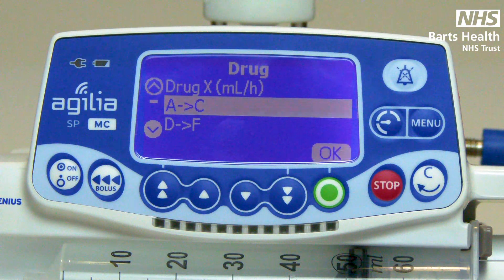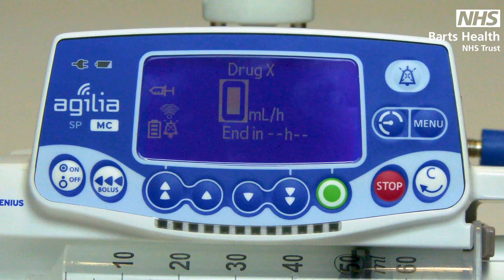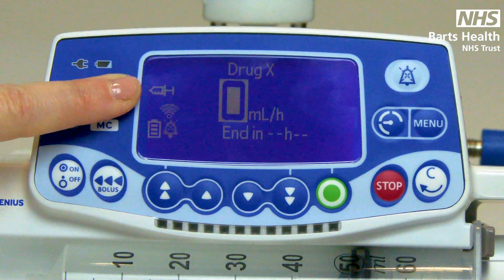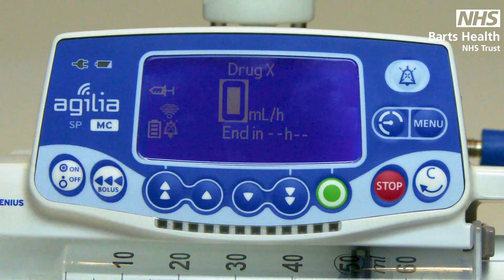Drug X is a mls per hour setting and will always be found at the top of the menu. On the home page there will be a syringe when working in Drug X, or a lighthouse when working within the drug library, a Wi-Fi symbol, battery indicator, and a pressure gauge. The pressure gauge works much like a speedometer — if your pressures increase, the dial will move.